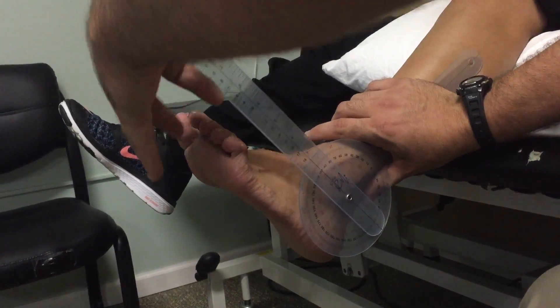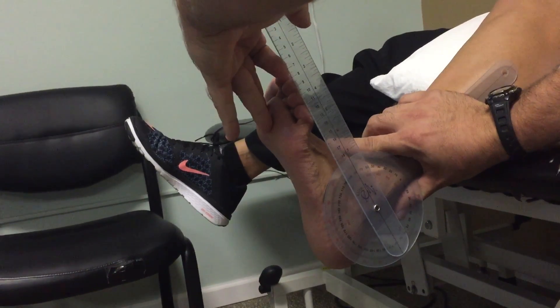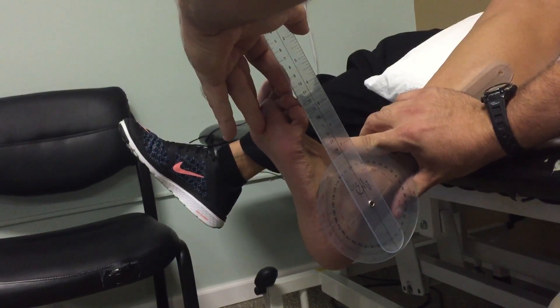Have the patient move their foot towards them as far as possible and you will get a reading between 15 and 20 degrees.